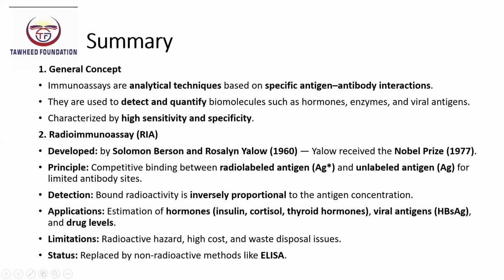So, summary of today's class: general concept. Immunoassays are analytical methods based on specific antigen-antibody interaction, used to detect and quantify biological substances with high sensitivity and specificity. The earliest and most sensitive immunoassay was the radioimmunoassay, RIA. It was developed by Solomon Berson and Rosalyn Yalow in 1960.